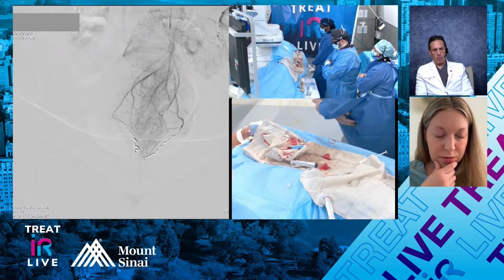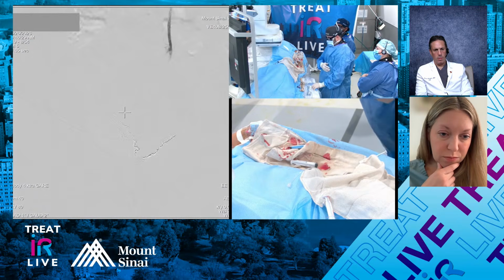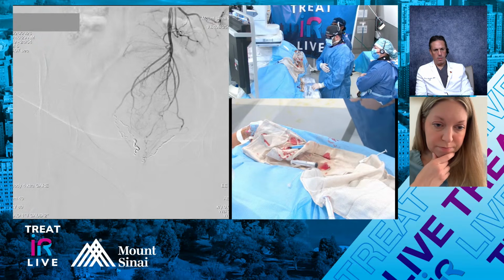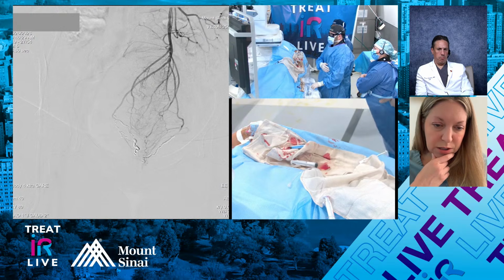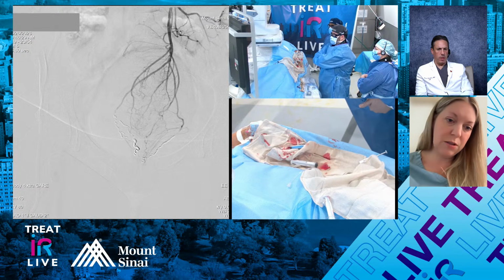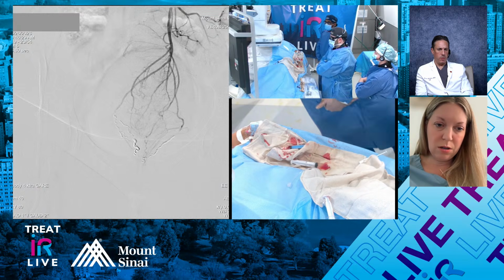So I'm injecting pretty hard here. And on the original run, we had a very nice blush of the corpus cavernosum recti. I'm not appreciating that much. There is that left-sided branch that's coursing medial and going down, but it doesn't look that hypertrophied. I'm going to leave that alone. This is a great result. You still see great rectal perfusion, and you just don't see that cavernosal perfusion down at the bottom.